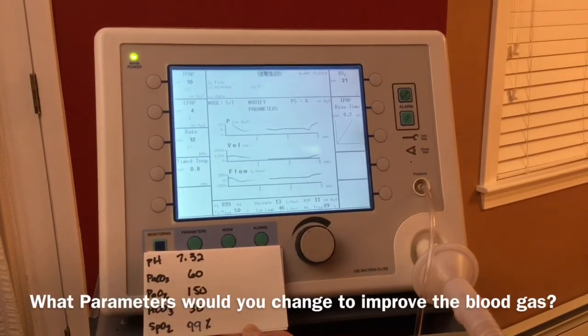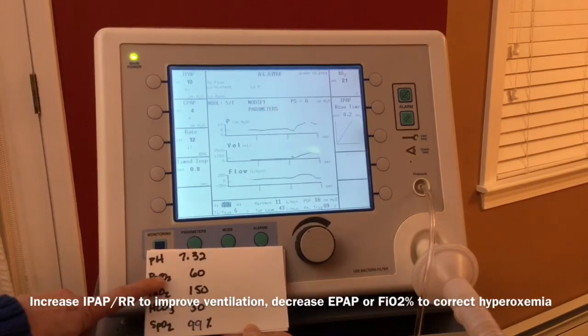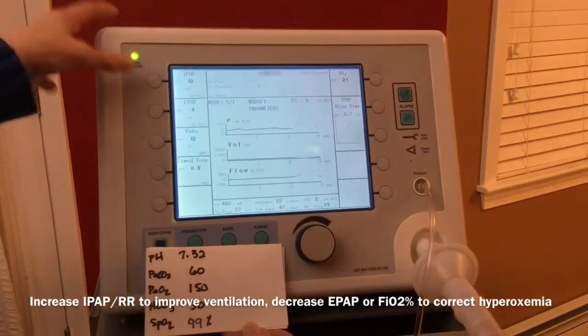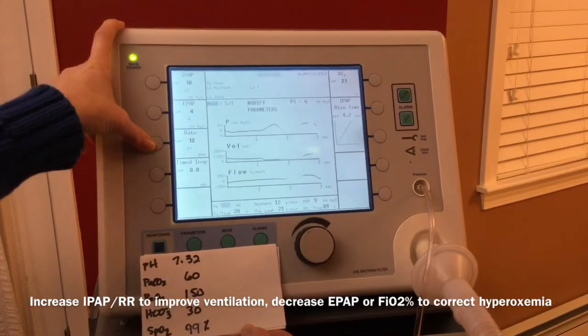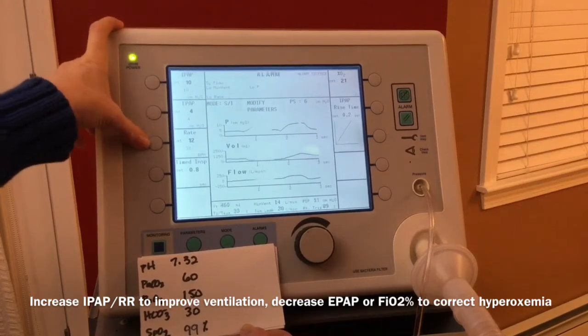Is this a ventilation issue, an oxygenation issue, or a combined problem? Pause the video. If you said this was a combined ventilation and oxygenation problem, you were correct. To correct the ventilatory defect, the patient is hypercapnic. To better ventilate the patient, you could again increase the IPAP or increase the respiratory rate. Increasing the IPAP would increase the patient's tidal volume. Increasing the respiratory rate would increase the overall minute ventilation.